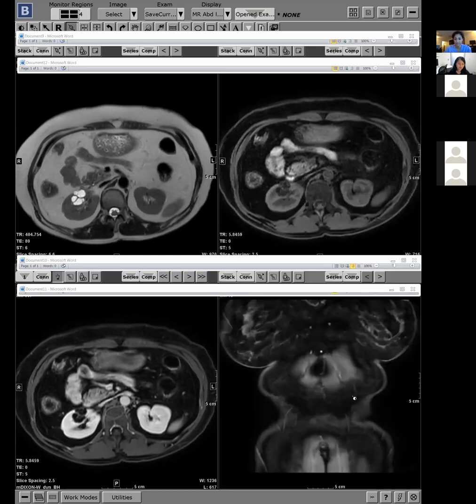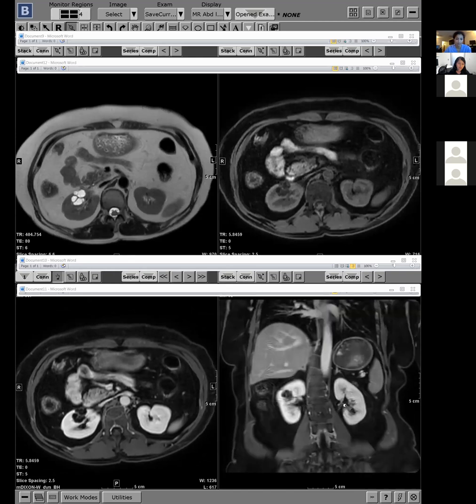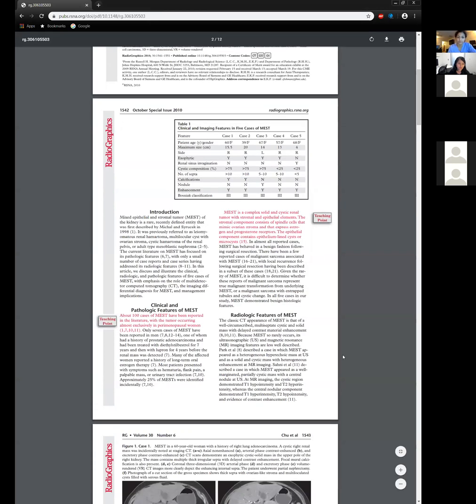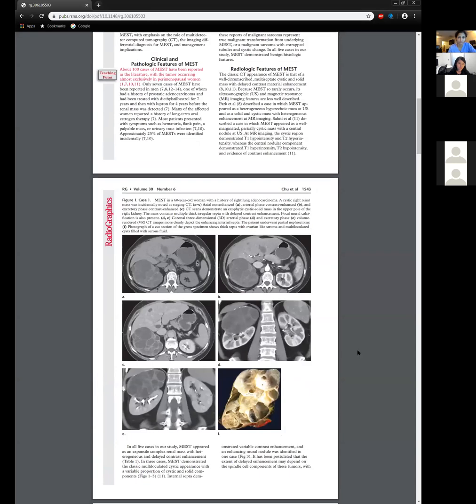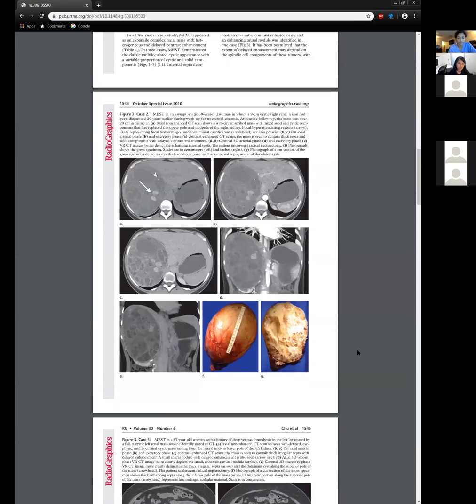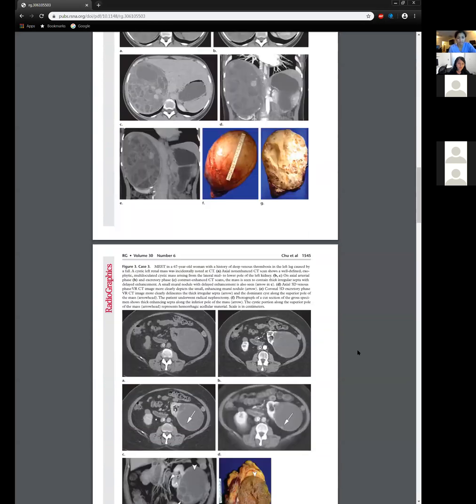So I thought it was multilocular cystic nephroma, and they followed this patient for 3 or 4 years, and it was slowly growing. So they took it out, and the path is, as you guys said, MEST, mixed epithelial and stromal tumor. It's basically a low-grade benign lesion, but it really can't be differentiated on imaging. You can see that's what they look like, just complex cystic masses. It's hard to differentiate them from multilocular cystic nephromas and cystic RCC. So the final diagnosis requires removal.